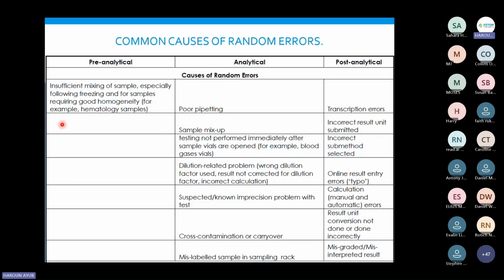Remember, as Antony had discussed in the previous webinar, the conditions that you're subjecting this particular analyte to will determine the result. So if you have bilirubin, and you have a very brightly lit laboratory, and you put your vial closer to the window where it's hot or closer to direct sunlight, it will affect the particular analyte. So remember, you have to put it in the dark and store it appropriately. Those are just some of the things that you need to focus on during reconstitution.